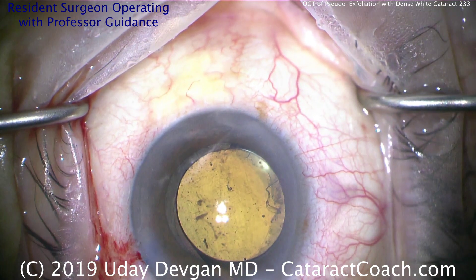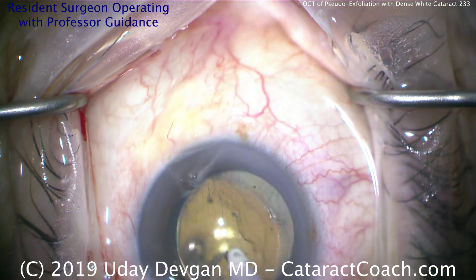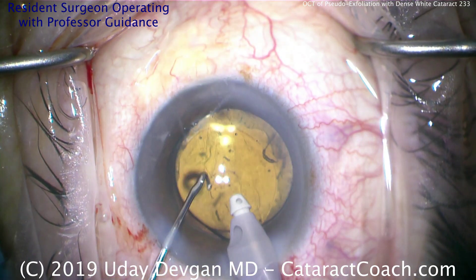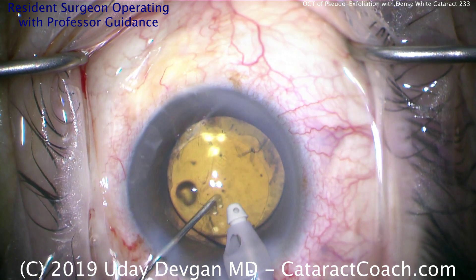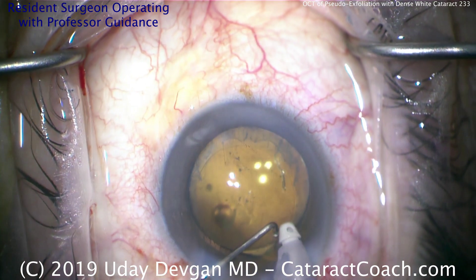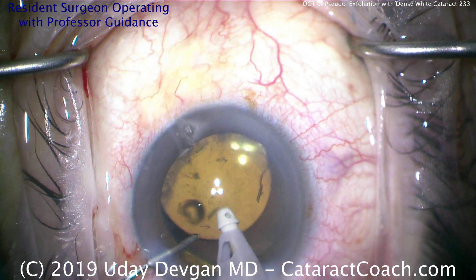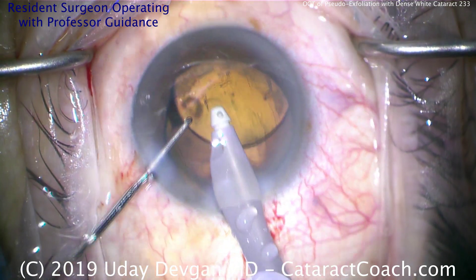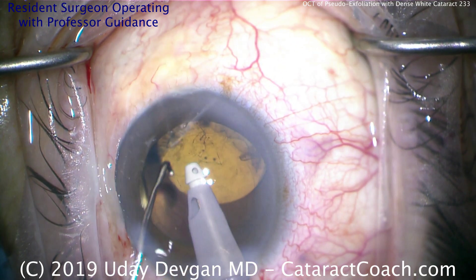The trailing haptic near the incision is not quite in the capsule bag. Using the infusion of BSS from the eye probe in the right hand and the chopper in the left hand, let's dial this lens around and make sure that trailing haptic goes in the capsule bag. A little bit of a struggle here — that's okay, that's how we learn. Putting the chopper at the haptic-optic junction and rotating clockwise — dial it into the capsule bag. There we go — and that snapped in the bag.